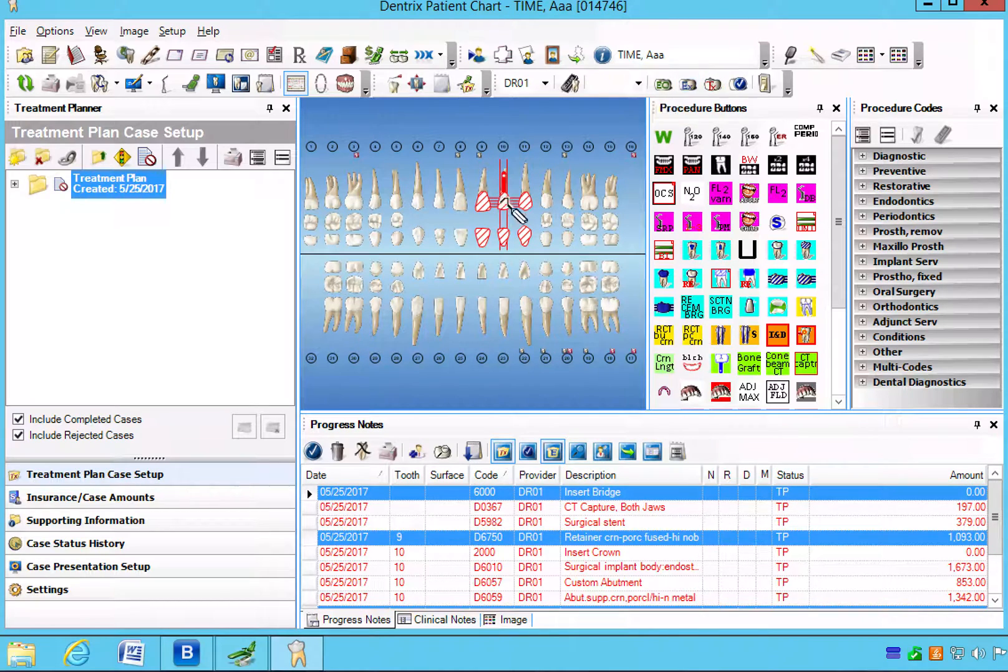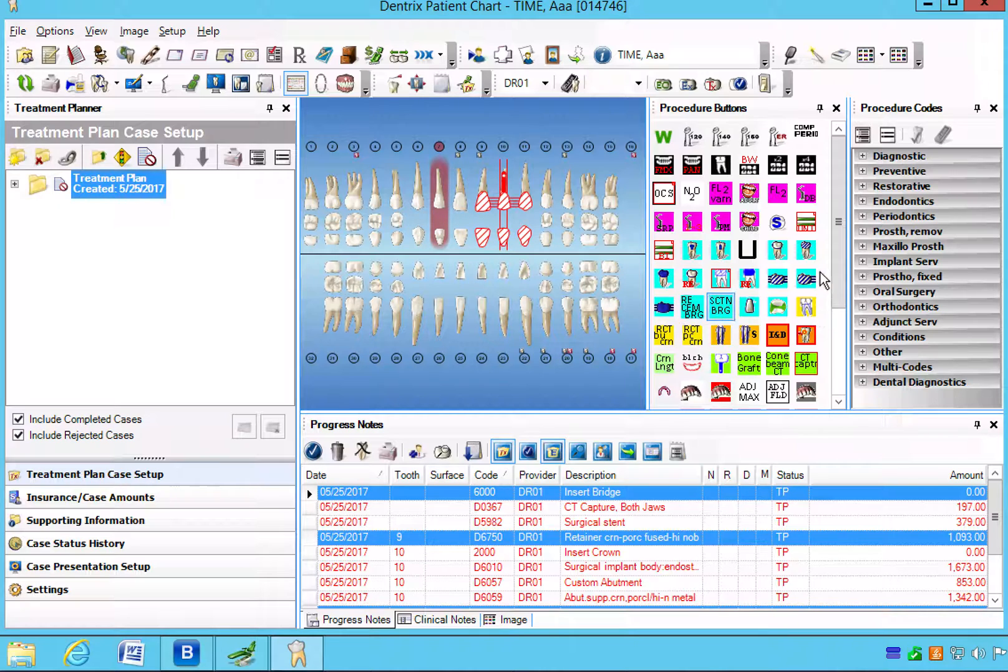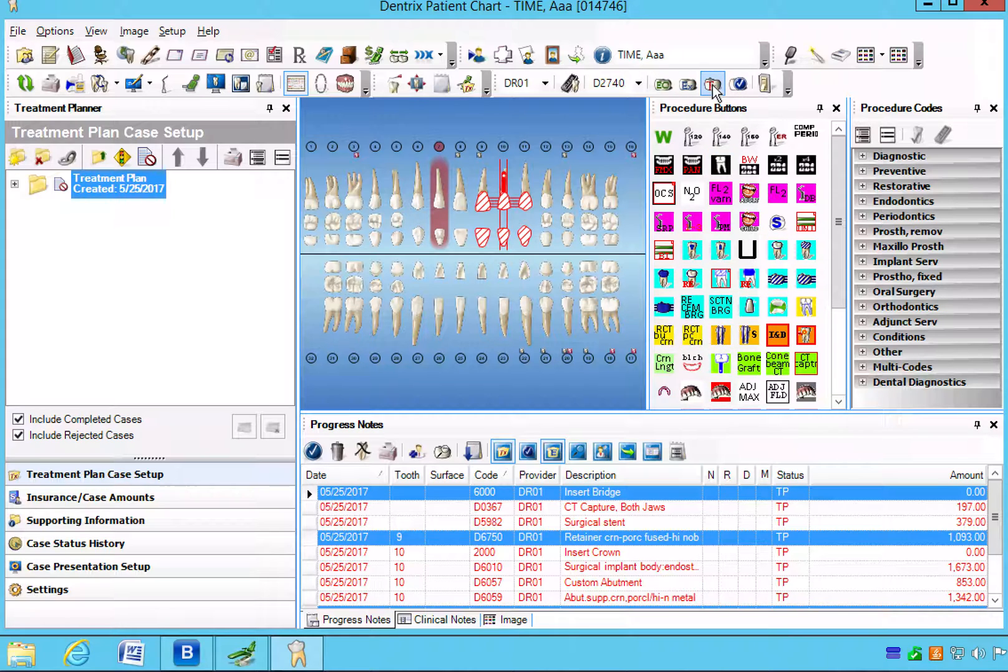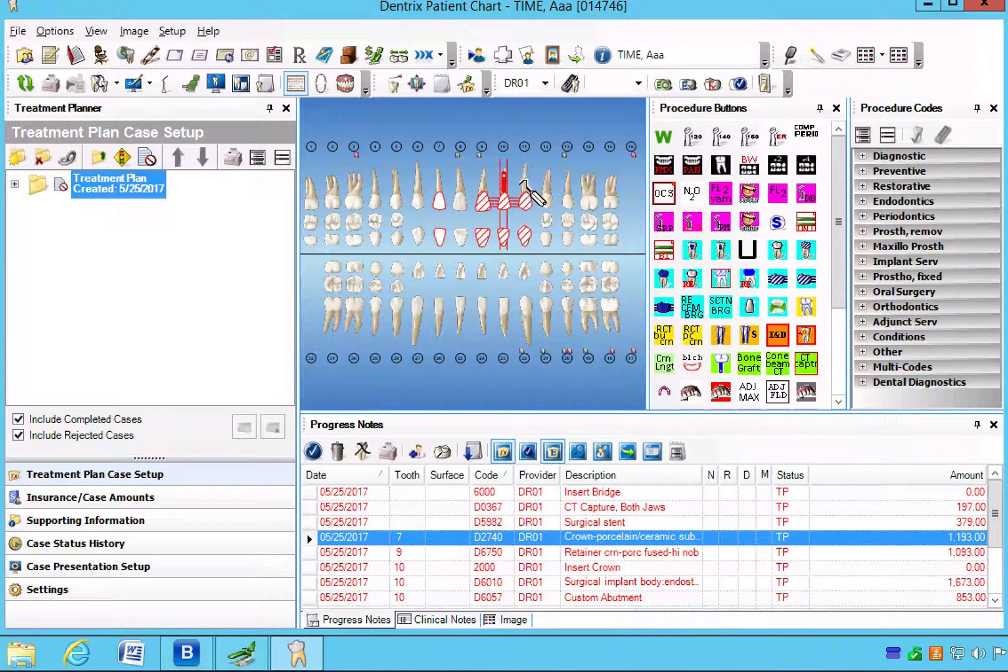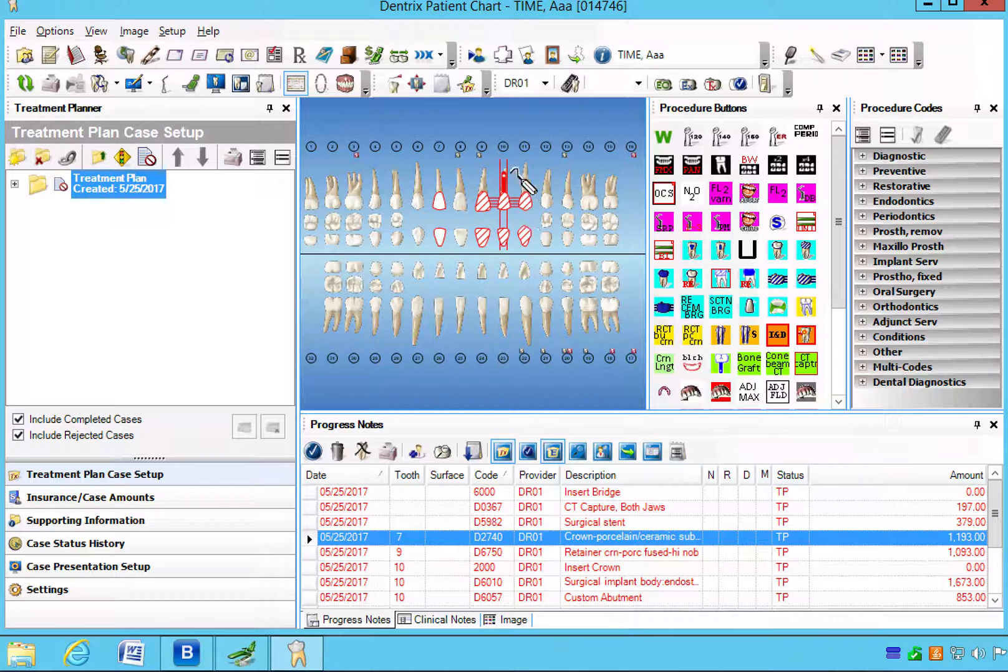So we have our mandatory and our alternate optional items, and we're also going to pick a crown on number 7 as an elective item. So we're going to click on all porcelain crown and treatment plan that. So as of right now we have the mandatory tooth that needs to come out, the elective option of the crown, and the alternate options.